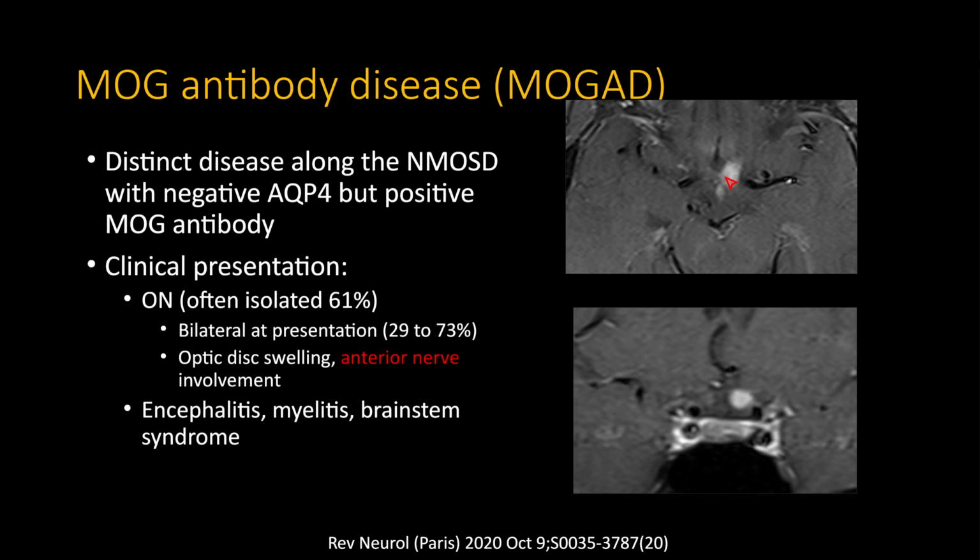So again, I personally don't find distribution of optic nerve involvement to be very helpful, because I've seen so many cases where those supposedly classic rules get violated, but that's just something people say. And if you read about these in things like Radiographics, you'll see these things mentioned, but I don't personally find them helpful.